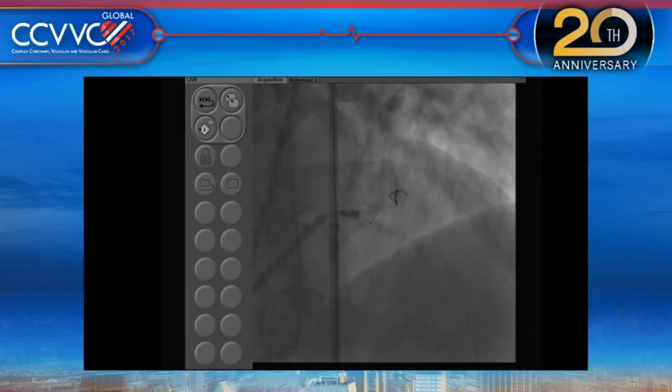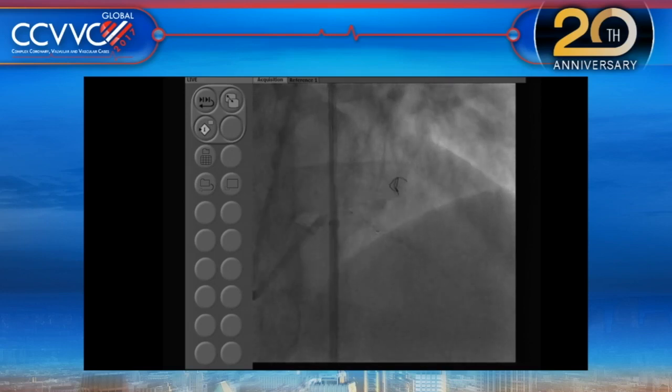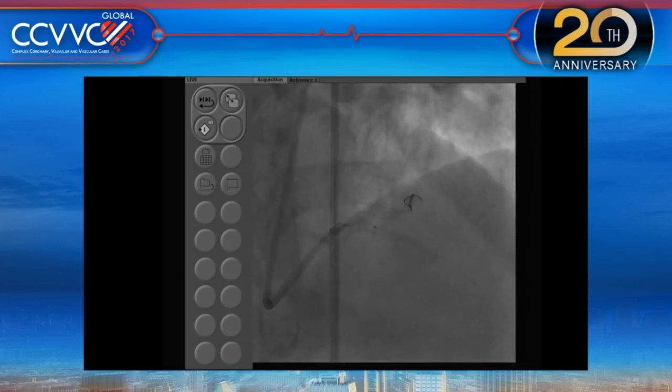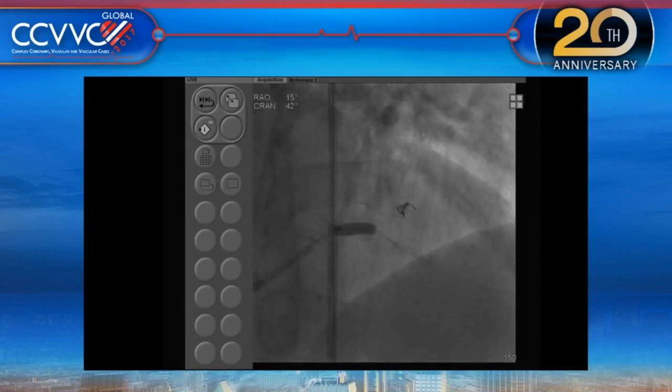No, but this circumflex was so difficult. Without question the circumflex would not have been done, but maybe in the LAD, I like the idea. I think the historical data with IVUS and arcs of calcium is what everybody really reaches for when choosing to do rotablator too. Because I can tell you that with OCT there is no clear definition of what is severe calcium.